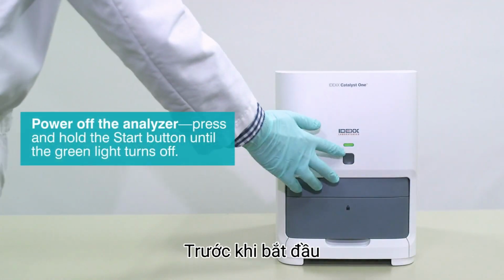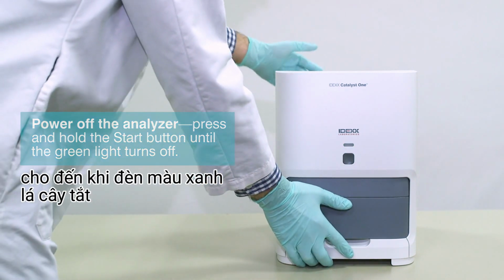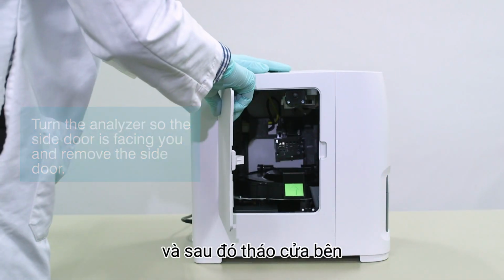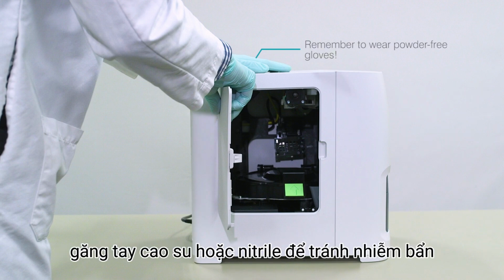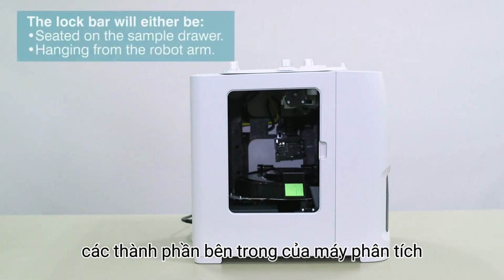Before you begin, power off the analyzer by pressing and holding the start button until the green LED turns off. Turn the Catalyst 1 analyzer so that the side door is facing you, and then remove the side door. Before you make contact with the internal components, be sure to put on a pair of clean, powder-free latex or nitrile gloves to avoid contaminating the internal components of the analyzer.